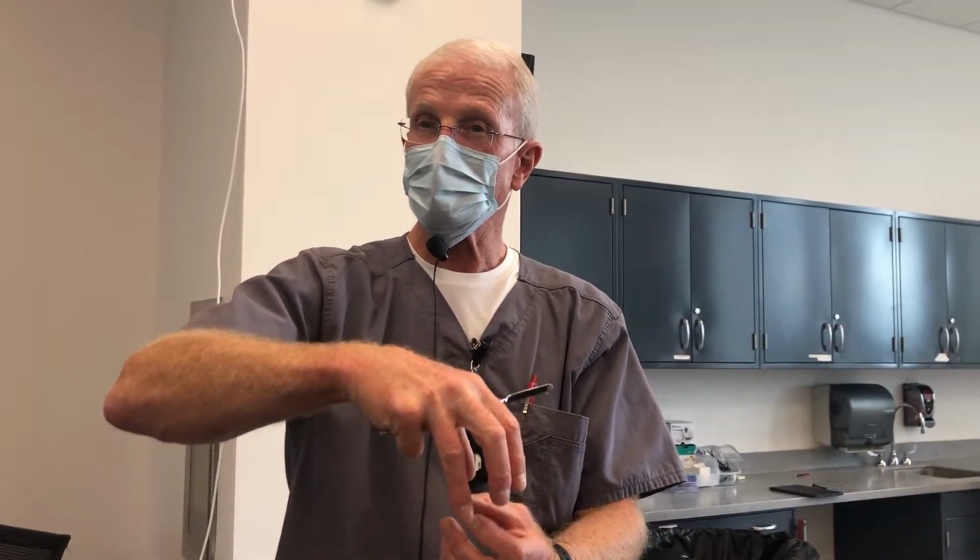And then you go, you look in there and you go to clean it up, well, it's high, it has an open proximal contact, something's happened. You don't want that. So check, double check when you put it in, then you can put the cotton roll in again. Watch that your zirconia crown does not shift or move when they're biting pressure on it. Does that make sense?